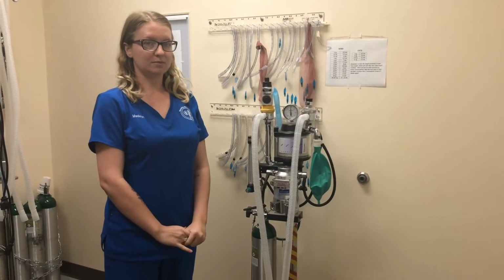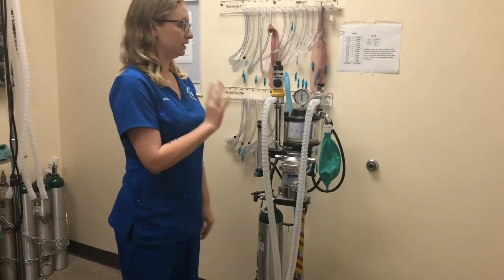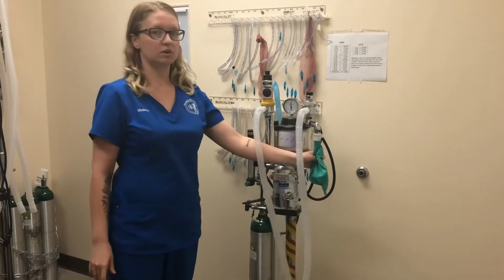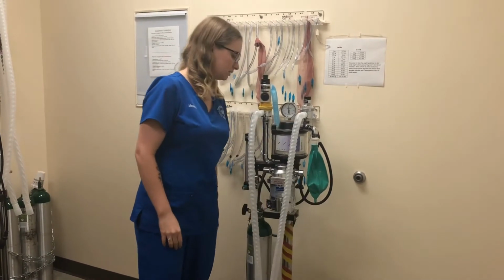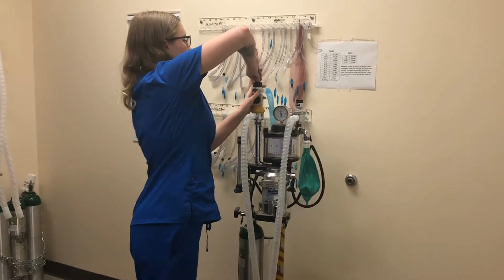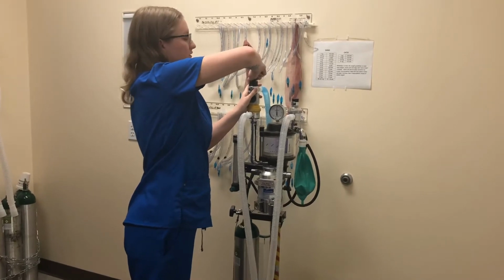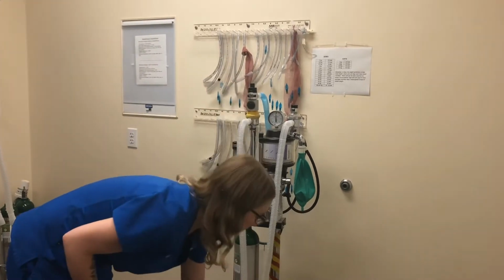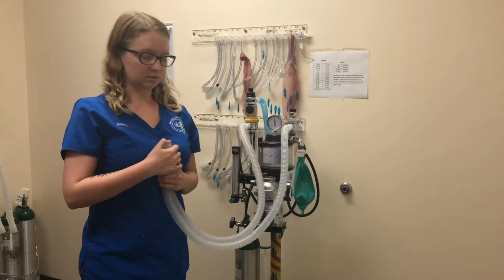Okay, now I'll be demonstrating how to leak test your anesthesia machine. I have everything already hooked up to the machine, so I have the anesthetic circuit hooked up and the reservoir bag. After I have everything on my machine, I'll turn my oxygen on. The first step is to close the pop-off valve. Then we will occlude the end of the circuit, which you can do with the palm of your hand or with your thumb.